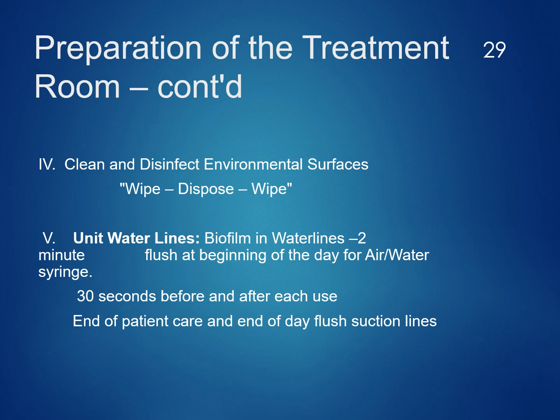As we continue with preparation of our treatment room, again, we're going to clean and disinfect our environmental surfaces. We're going to use that disposable wipe when you first come in. When you come into the clinic, you're going to clean the areas. You will then take your gloves off and wash your hands really well.